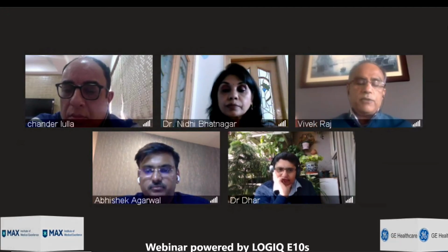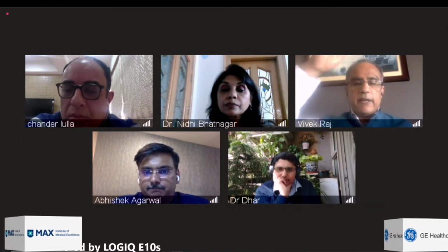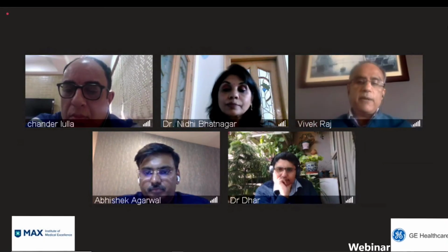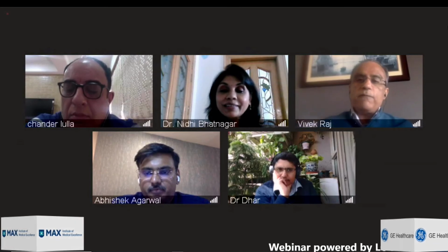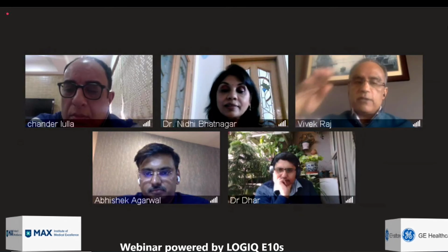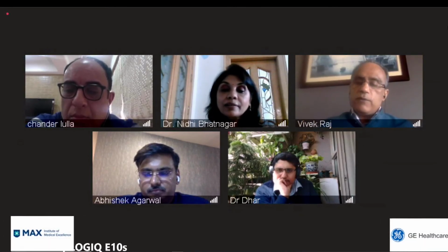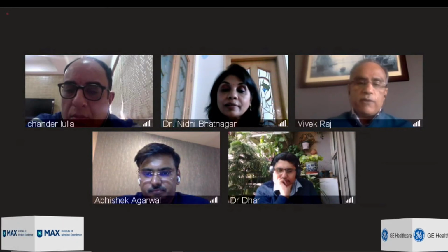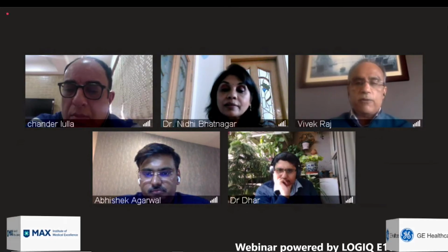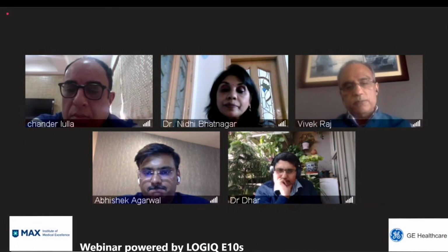So there are situations where I've had patients doing it as a follow-up every year, for example, and the trend is heading downwards and the clinical improvement is also happening. I would be very happy to say, yes, you are getting better and the liver is getting better. And you will have one off value which will be high. And again, the patient gets all worked up about it, and I say, no, we need to watch the trend. So in terms of following patients up with advanced fibrosis especially, I do it once a year or so. Doing it more frequently doesn't help because they have not lost weight, they haven't done anything, it's not going to change. But many patients, when they have done the right things, you actually see improvement in those.